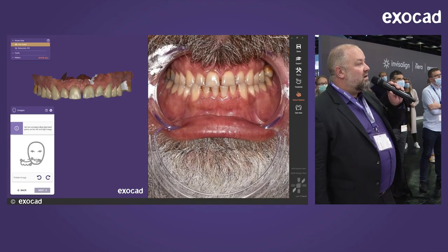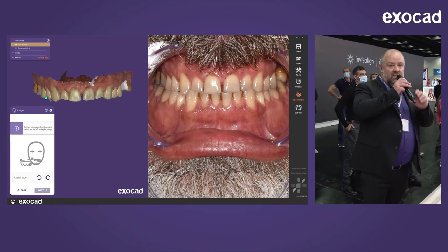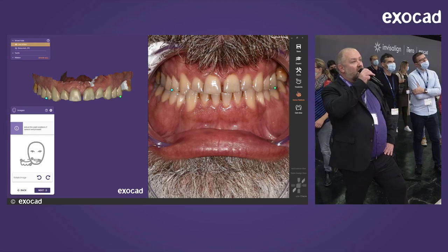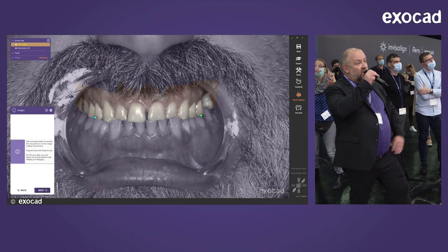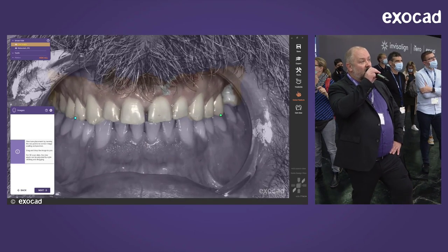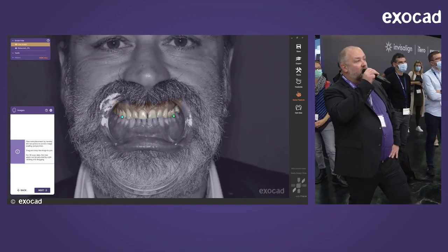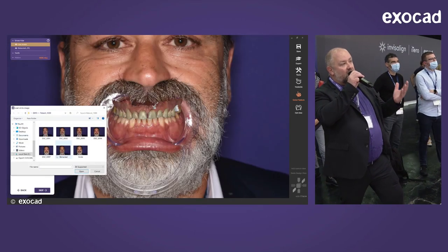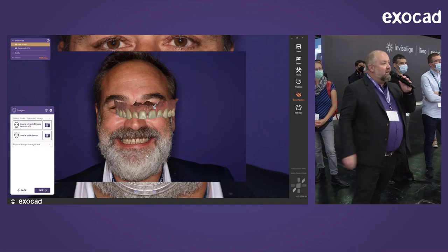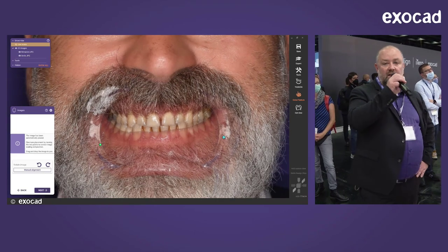Here we start the Smile Creator, which is actually an add-on module. What you see on screen is a matching between 3D and 2D: on the left side is the 3D intraoral scan, and Marco will now place just two points. The software perfectly matches the two pictures, scaling and placing them automatically onto the 3D scan. This is the first time we're using artificial intelligence in the software.